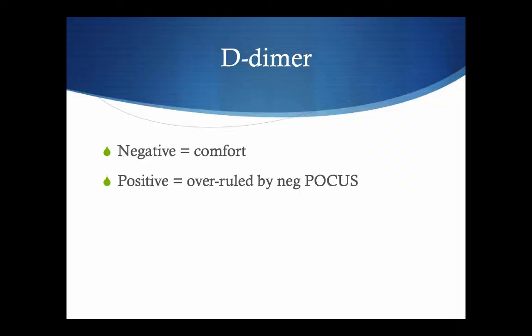All the guidelines talk about D-dimer first, then ultrasound. That's kind of stupid when you can do the ultrasound in 5 minutes and the D-dimer takes an hour. But if you do an ultrasound and you feel a little uncomfortable, you can add a negative D-dimer to give you more comfort level. So that's something to consider that keeps the patient from having to come back and clog up our ER the next day. I don't do that, but that's something to think about.